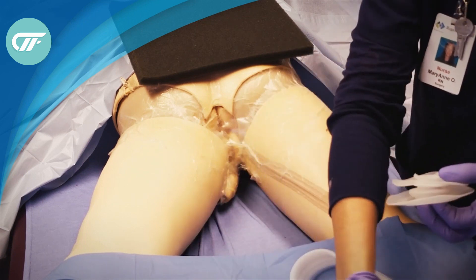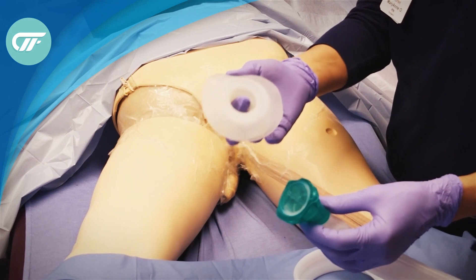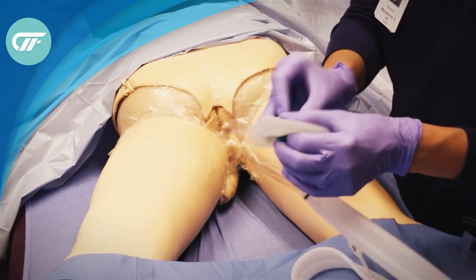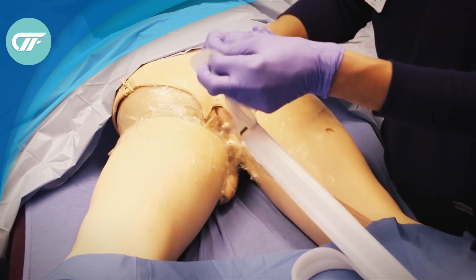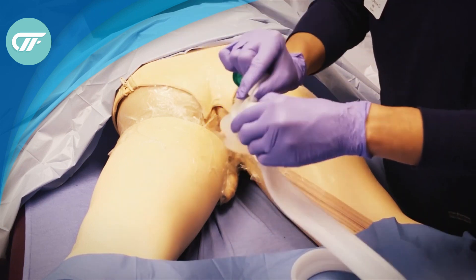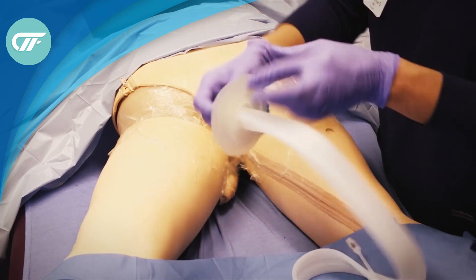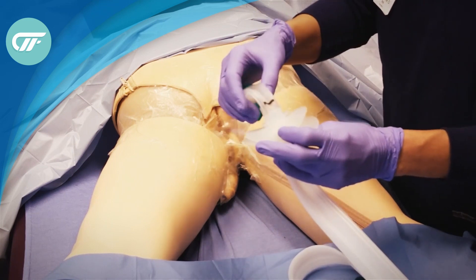So we'll go step by step. The first step is to load the fistula funnel onto the fecal management system. The larger flange is on the outside and the smaller one is on the inside.